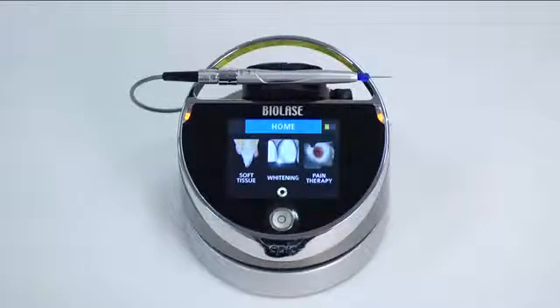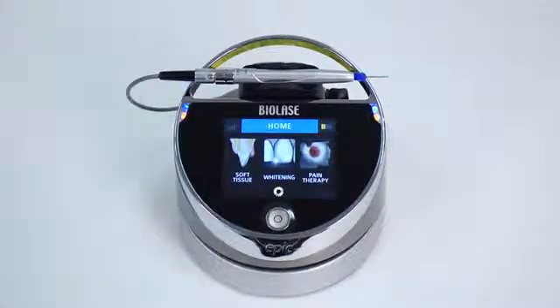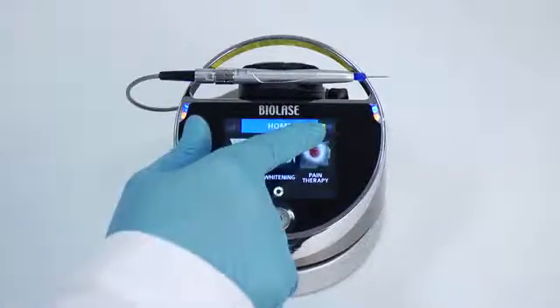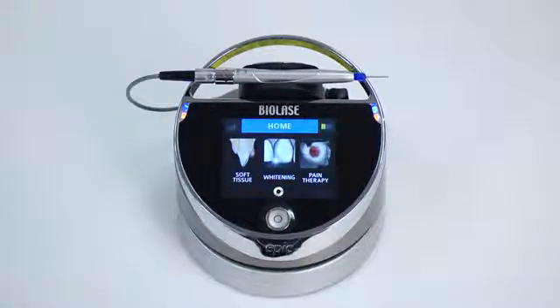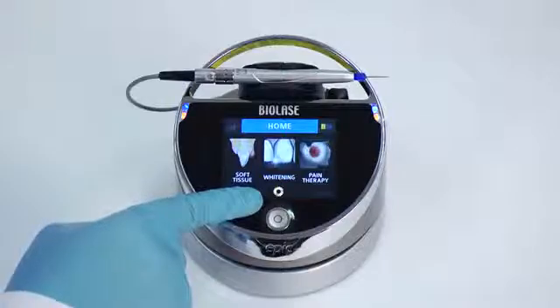Before proceeding, become familiar with several important elements on your EPIC home screen. The wireless signal strength indicator in the upper left corner indicates the wireless signal between your EPIC laser and its foot switch. You will also see the laser console battery strength indicator in the upper right corner, which indicates the remaining battery life for your EPIC system. Finally, you will see a settings icon to access the settings screen.